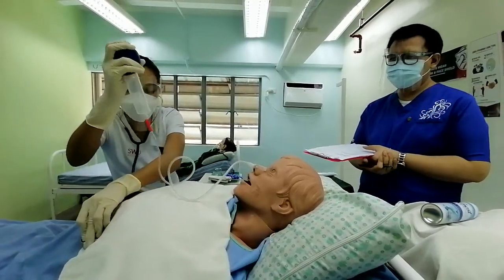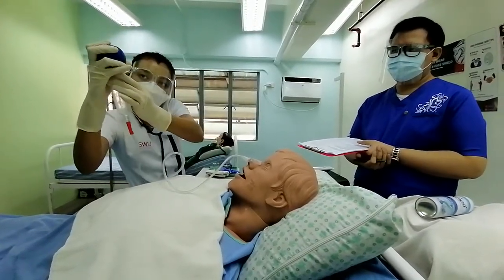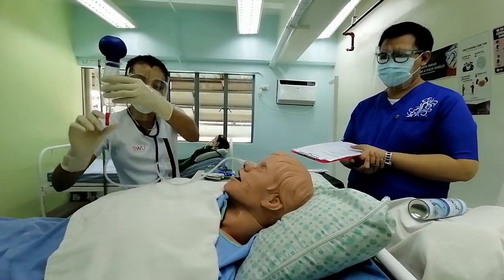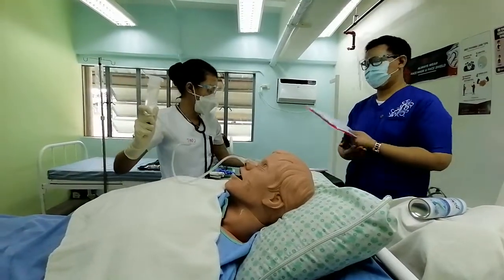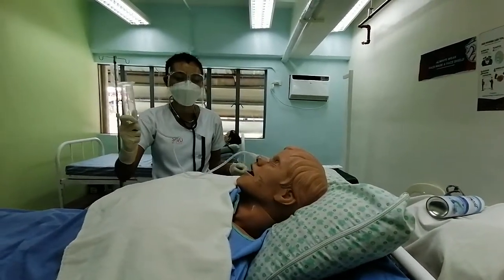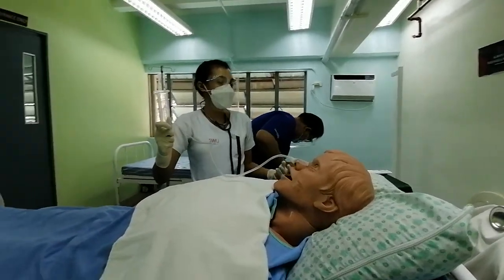Okay. And then, after checking the gurgling sound, I will then aspirate gastric contents. So when I do that, the gastric contents will be aspirated. And then I will check the pH using the litmus paper. The gastric content is acidic, meaning it is at the right place. Another way of determining the proper placement of the tube is also chest X-ray, which also needs a doctor's order.